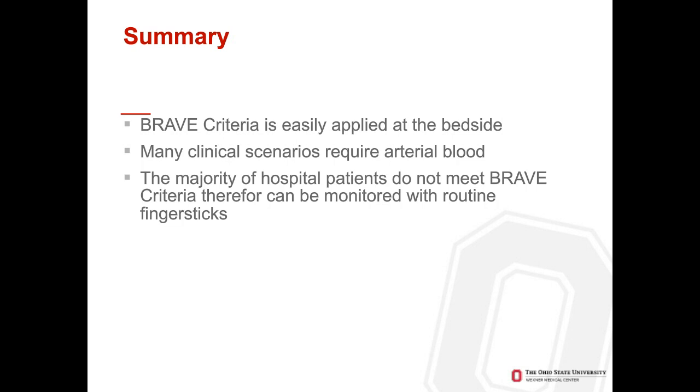insulin and how much. In our first few months applying this BRAVE criteria, we've actually seen a significant decrease in hypoglycemia related to insulin therapy. So we really feel that not only have we found an easy way to determine who should not be assessed with capillary glucose, but we've also increased the safety of our therapeutic decisions in our hospital patients.